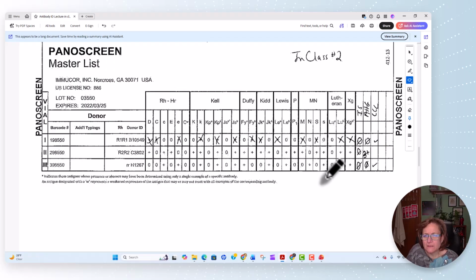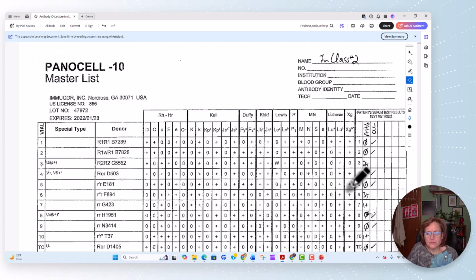And that's that one. My recommendation, you're going to pause right now, pause the video, do this second row, and then go into the next page and do these cross-offs. Then before you start the video, look at your reactions and see if you can figure out what the antibodies are. You know we're doing double antibodies, so that's kind of giving you a little clue. There should be at least two. And so see if you can figure it out when you start the video back up what it's going to be.